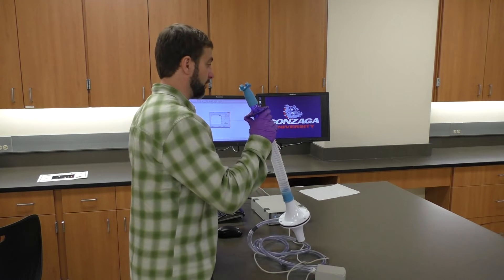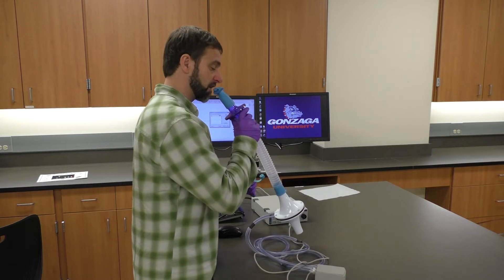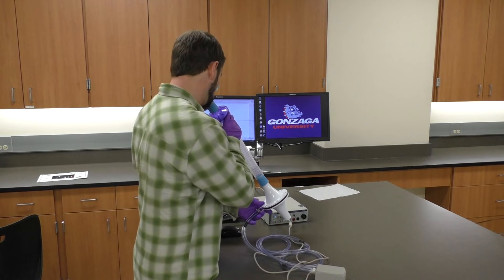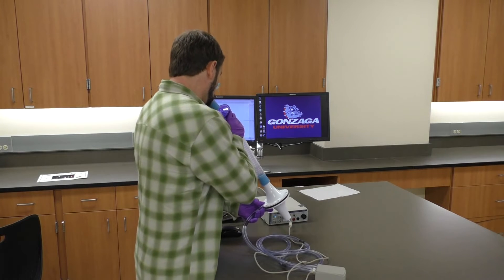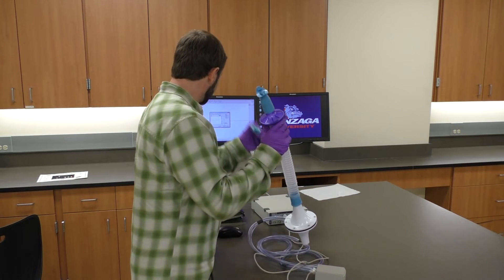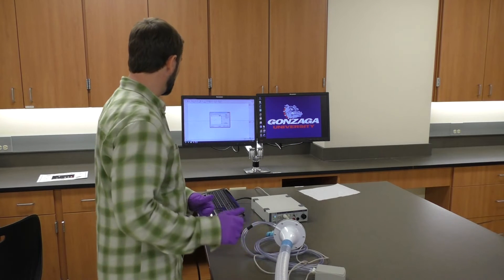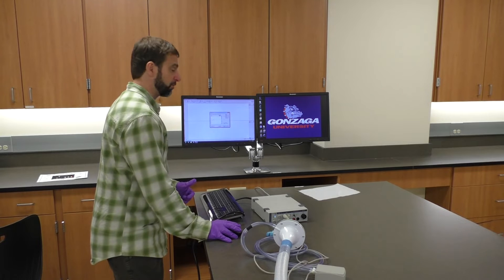Let's check the deflection again — exhale first and inhale second. That is now the deflection we want, and we're all set to move on to the next part, which is the calibration.